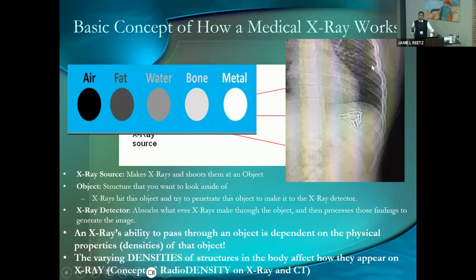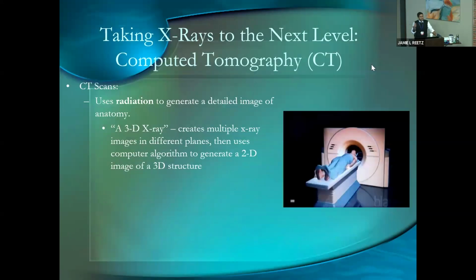The reason why I'm going to be harping on X-ray and this concept of radio density in a lecture about CT is because that is what I think of CT.